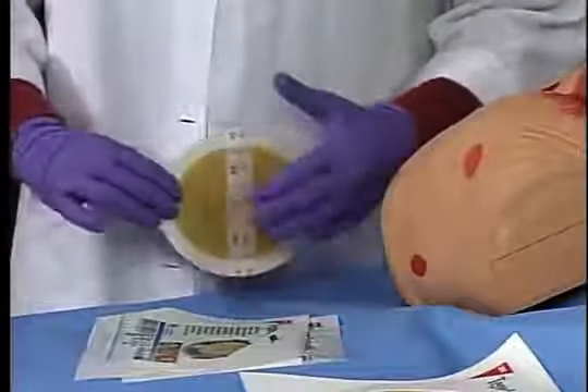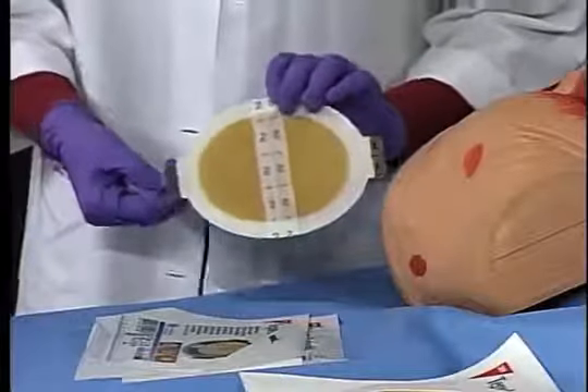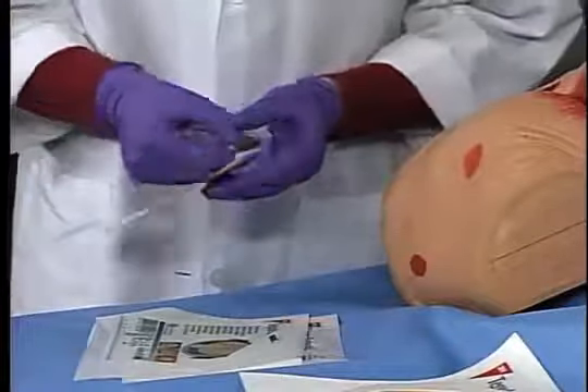You will remove the liner from the back of the dressing by lifting and pulling one of the square ends marked number 1 to expose the adhesive surface.